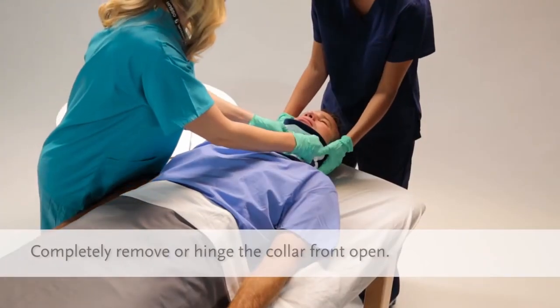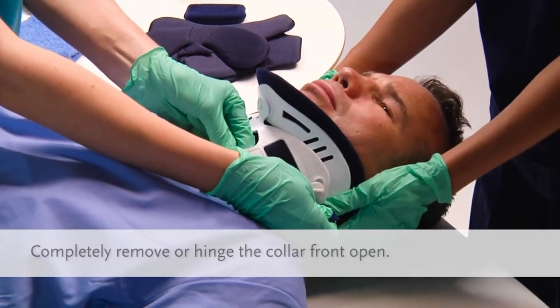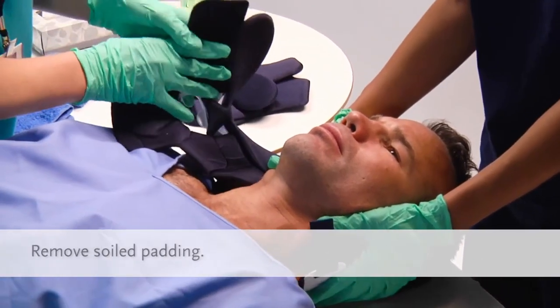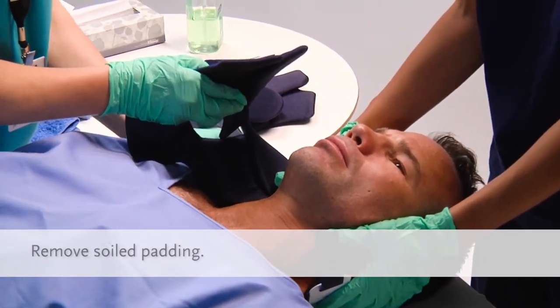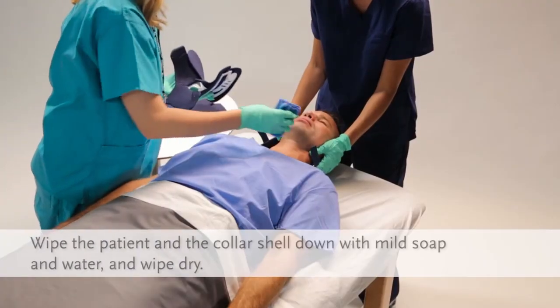Skincare is the most effective way to prevent pressure ulcers. Using standard C-spine precautions, start by removing the collar front. Remove the soiled padding and wipe down the patient and the collar shell.